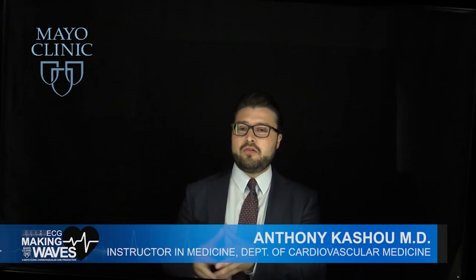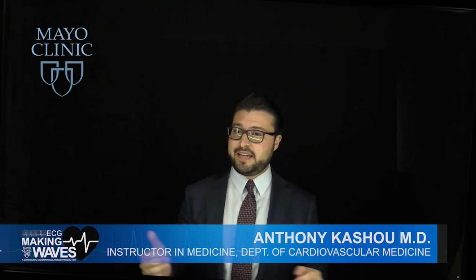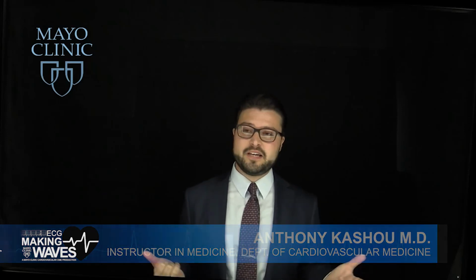All right. So again, story: an ECG comes to me, wide complex. I get this prediction, and then from that prediction, I make decisions. I guess this prediction doesn't remove my competency in interpreting ECGs. It produces a reproducible result because it's computer generated, and there's no human error or bias.